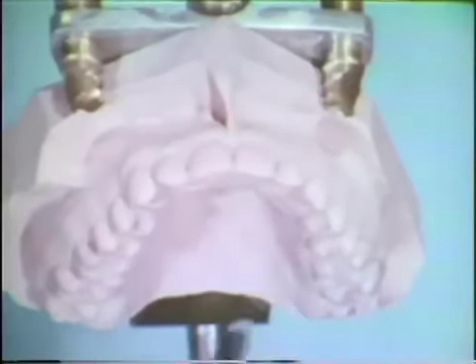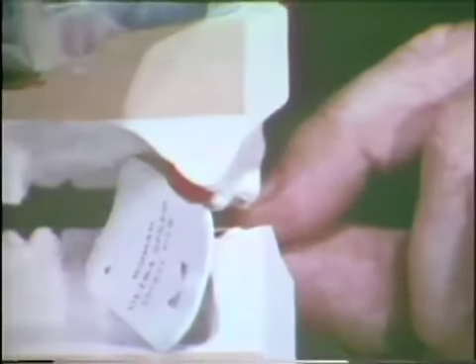This model exhibits gingival hyperplasia in the upper molar area, which may be an obstacle to film placement. Red wax has been added on this model to simulate such a condition. As the film is inserted and the mouth closes, we see that the obstacle displaces the posterior portion of the packet downward.